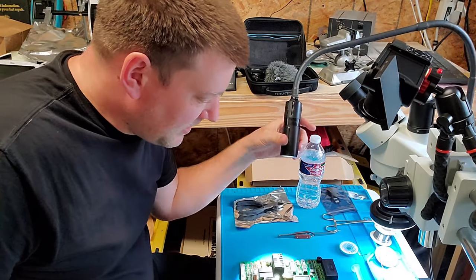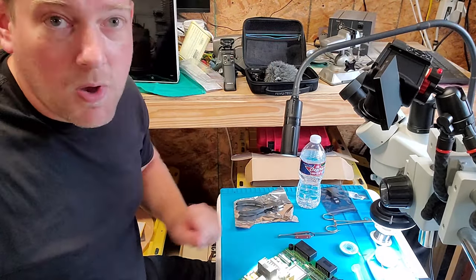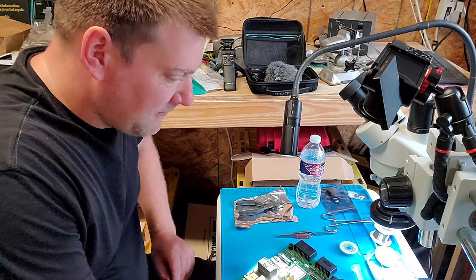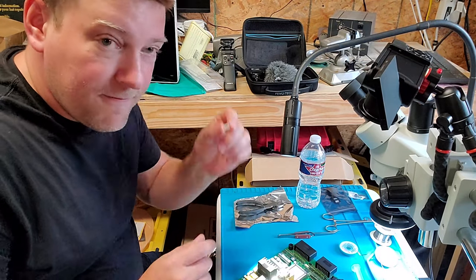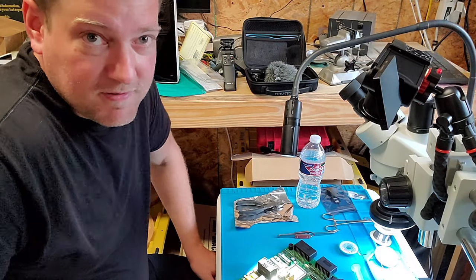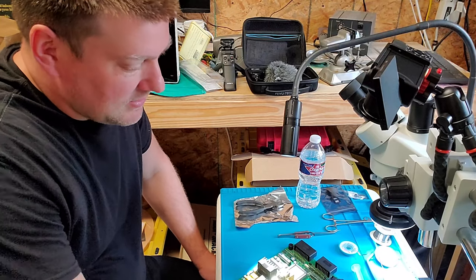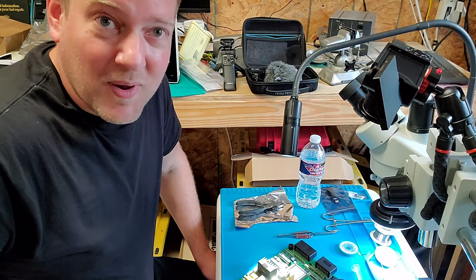I've got everything set up right here. I hope this all comes into focus the way it should. So let's get started. I've got my hot air supply front and center, and my soldering iron is on. I've got my pico fuse right here and my photo solid state relay right here. I bought multiples of these because they're cheap, very inexpensive, and very hard to get. So I bought 10 of the photo solid state relays and 5 to 10 of these pico fuses. So let's get into it.